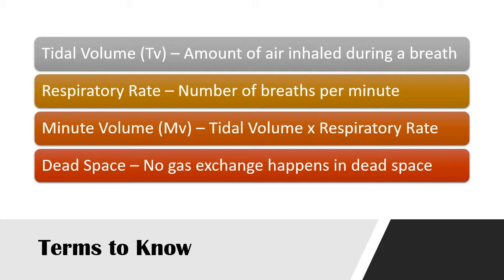And most ventilators are going to express that to you. It's usually expressed like this: a V, a T, both uppercase, and then a little E. And that reading is your exhaled tidal volume as your readings come across your ventilator. So, important thing to know.